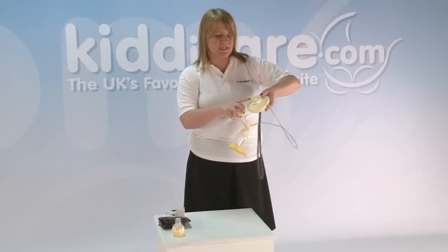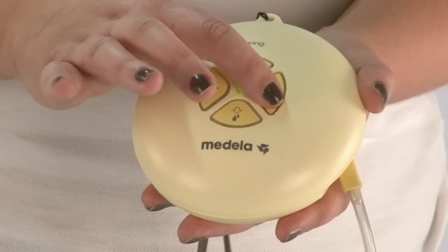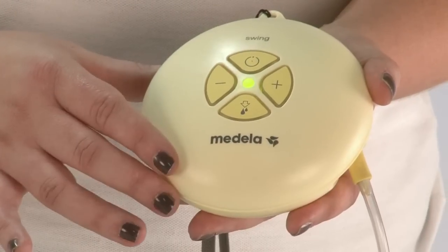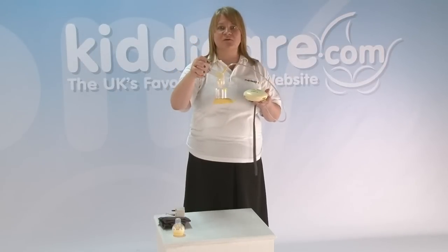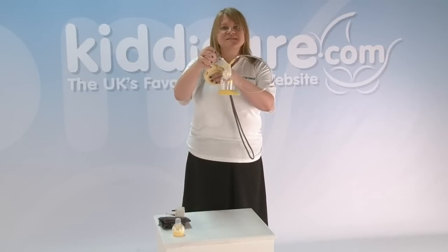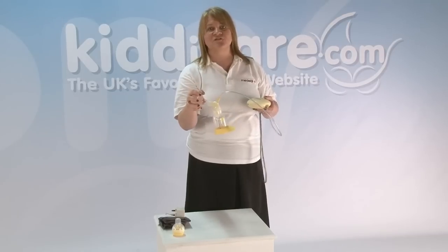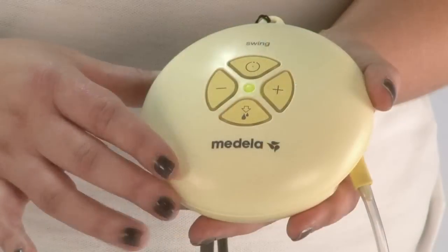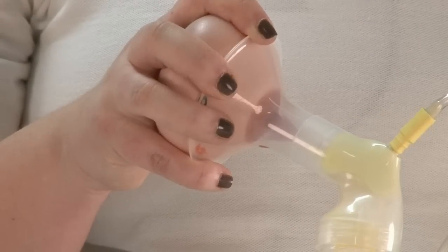The way we change the vacuum is with the plus and the minus. To judge it, you turn it up until there's slight discomfort — don't leave it there — then turn it back one or two with the minus. After the two minutes, the pump will slow down to the second part, which is the expression phase. If mum starts to see milk appear before the pump has slowed down, she can slow it down herself to save a little time by pressing the button with the droplets on it. You'll see that the pump has now slowed down — that's the expression phase.